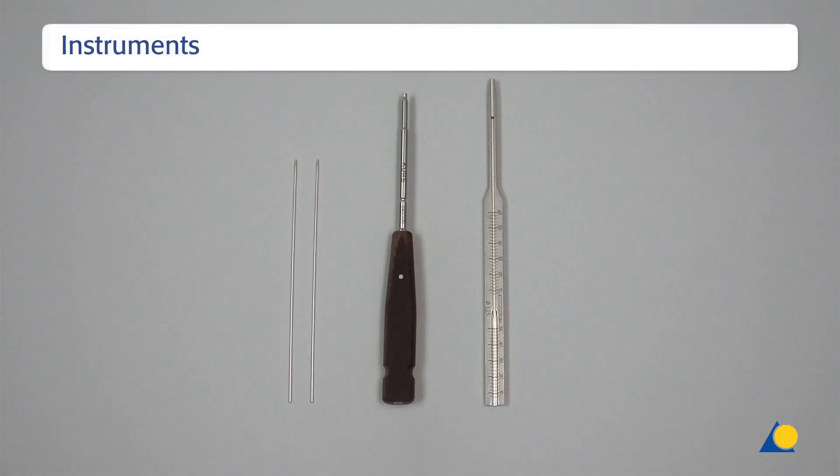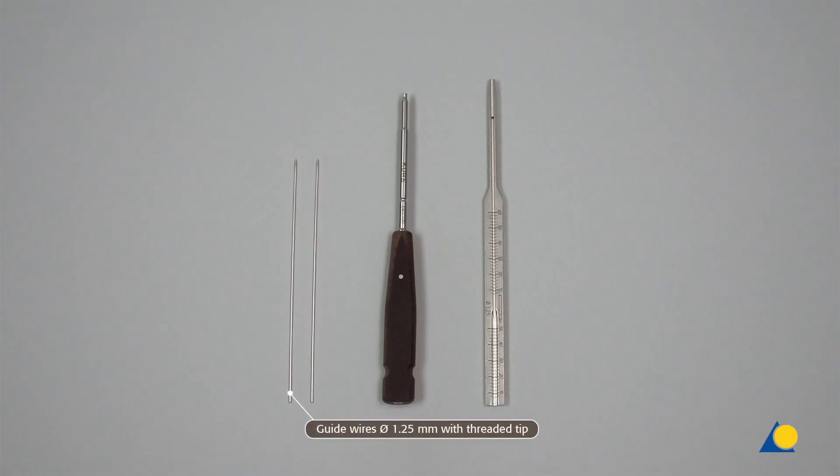The required instruments include: the guide wires (diameter 1.25mm with threaded tip), the cannulated hexagonal screwdriver for the 4.0mm cannulated screws, and the depth gauge.